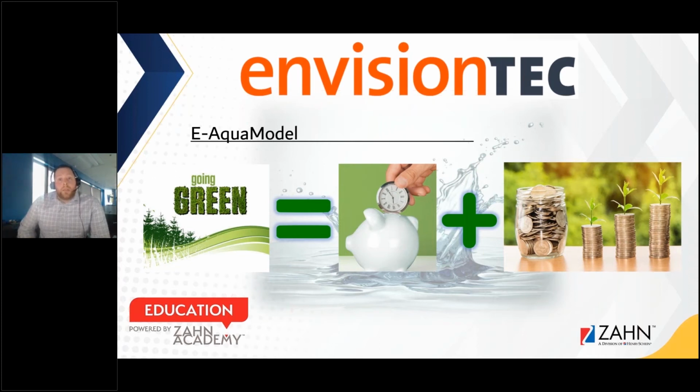But typically, in this essence, the going green aspect allows us to save both time and money on the printing side, because it allows us to take what we formerly had as a 40-minute process and shrink that down, both in time and in money, because we no longer have to pay for the excess amounts of IPA or the disposal of the IPA alcohol and the resin mixtures. So there's a lot of advantageous aspects to this E-AquaModel, which I think is going to be great for our industry and great for our particular workflows.